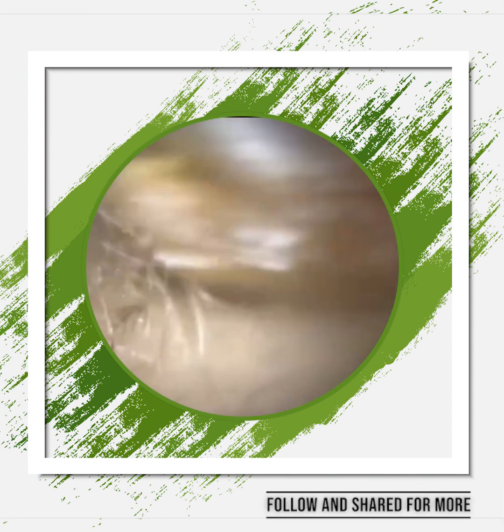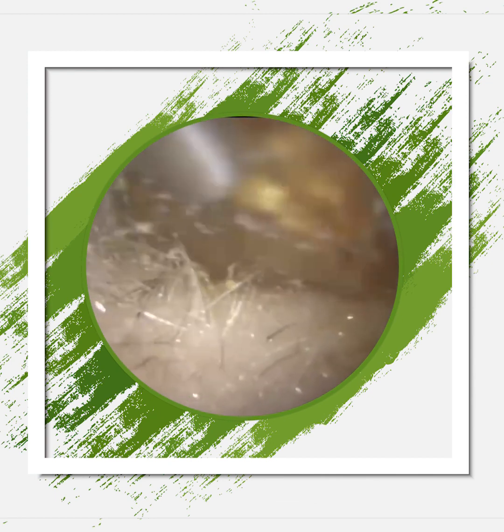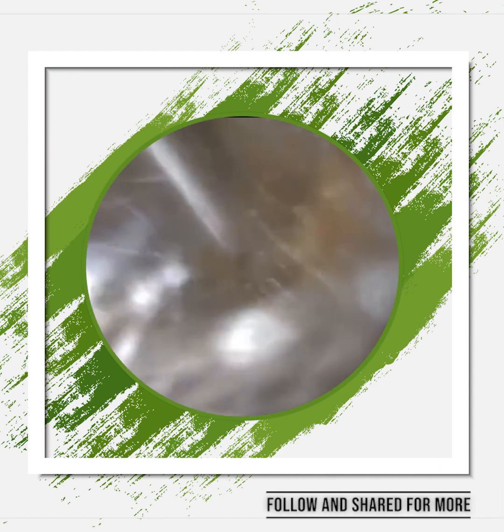And let's have the patient here. So this is the patient's left ear, and again, this entrance is really, really narrow. And I've put some drops in straight away. I've managed just to wriggle this wax out to the entrance here, but there is a bit more deeper in the ear, and I'll talk through the technique here to be able to get this.